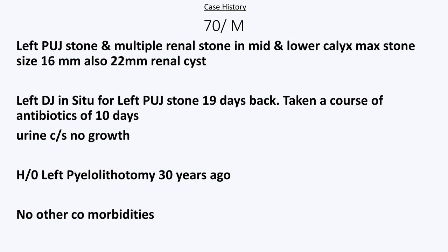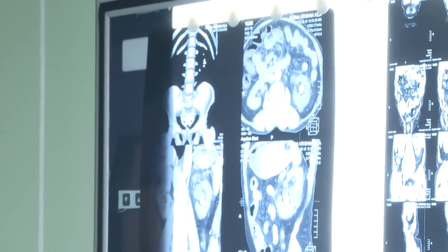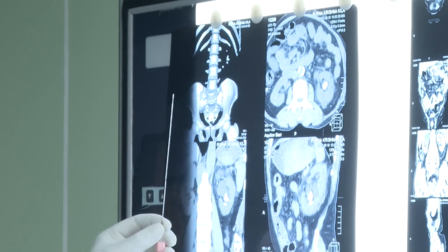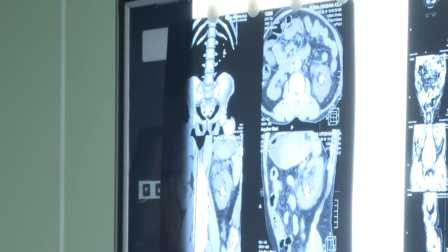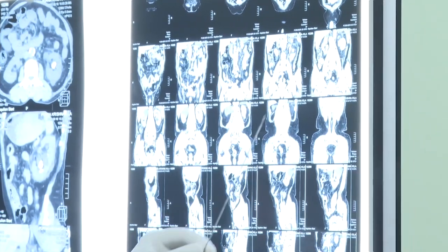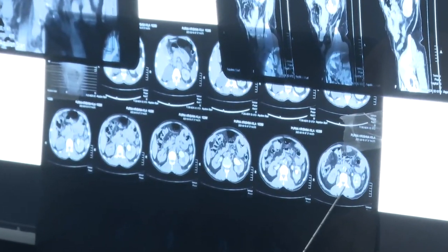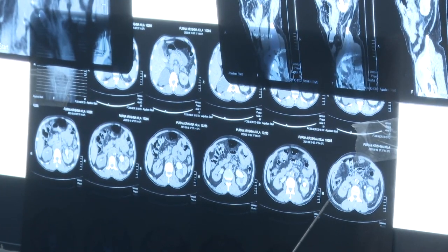Here is a CT scan of a 70-year-old patient with a PUJ stone and multiple stones in the left kidney. The bulk stone is in the lower calyx. This patient had ureteral stenting 19 days ago due to severe loin pain. On IVU, there is good excretion, but this lower pole is covered by the colon.